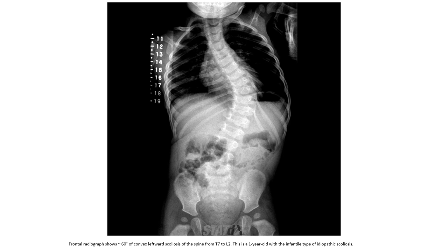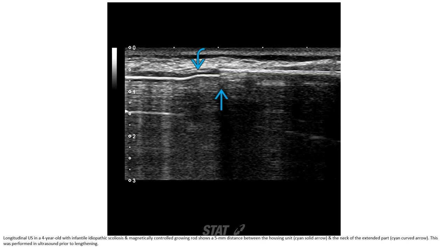This is a one-year-old with infantile type of idiopathic scoliosis. This is an ultrasound image of a four-year-old with infantile idiopathic scoliosis. A magnetically controlled growing rod was placed. The image shows a 5mm distance between the housing unit and the neck of the extended part, performed on ultrasound prior to lengthening.